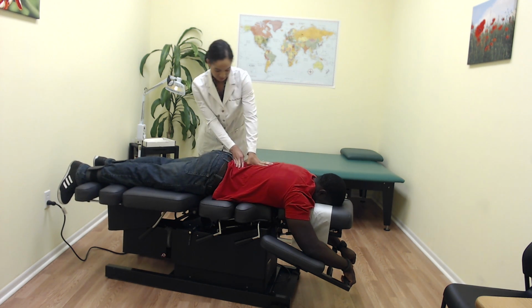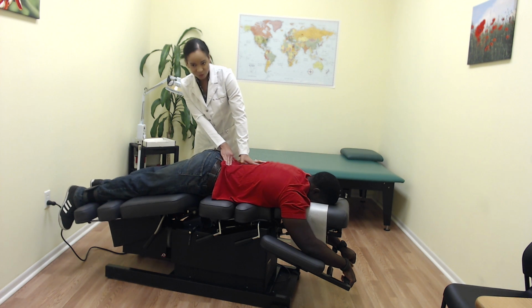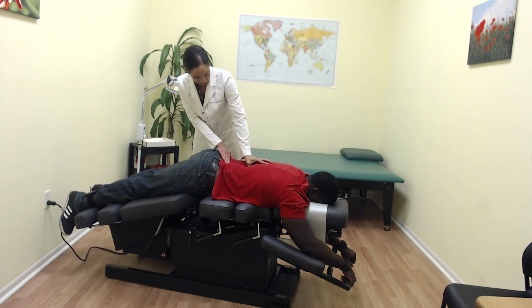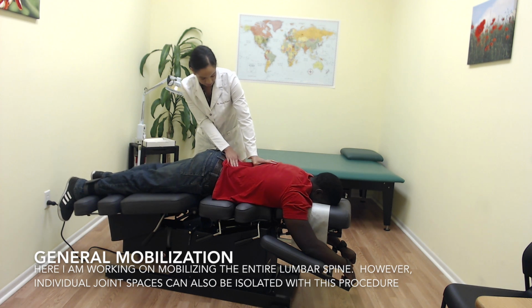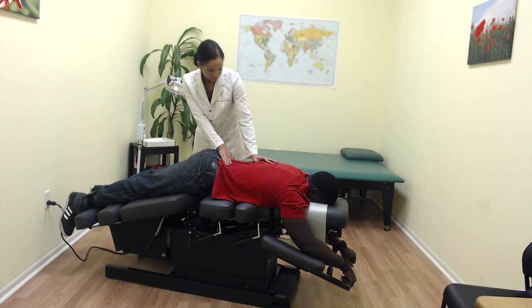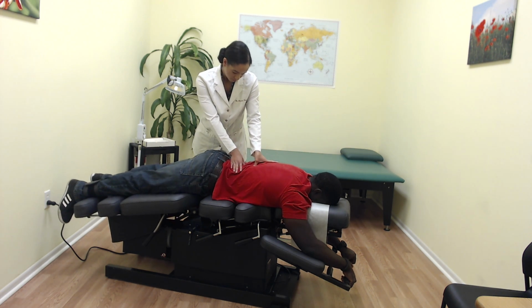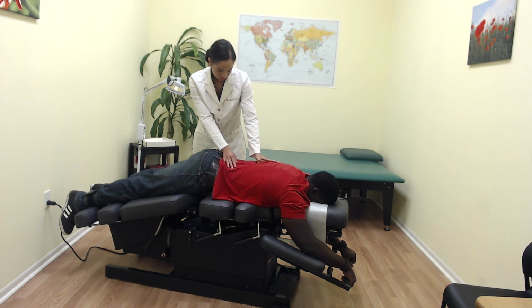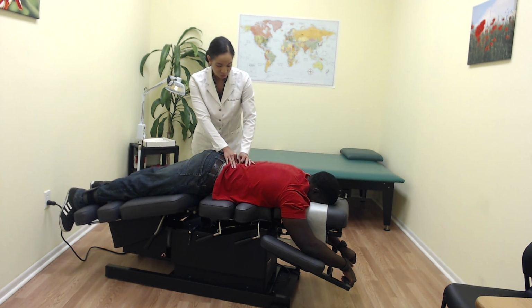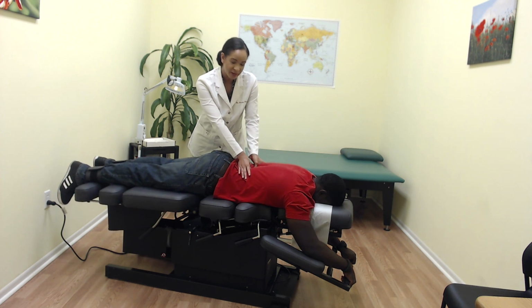Is that comfortable? Mm-hmm. So you can see as the table's moving down and stretching the spine, I'm just giving it a little bit added stretch. Let me know if it gets uncomfortable, okay? If I want this to focus on a particular spinal level, I can just apply pressure at that particular level, and it'll help to stretch that specific level of the spine. But we're just working through the whole low back here.